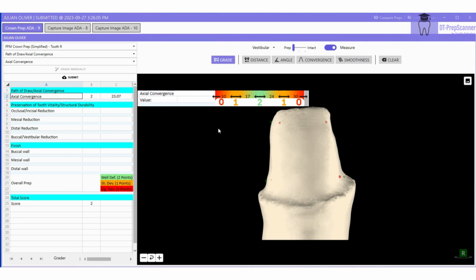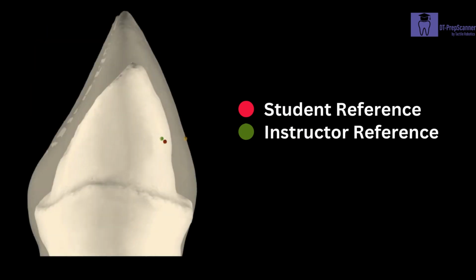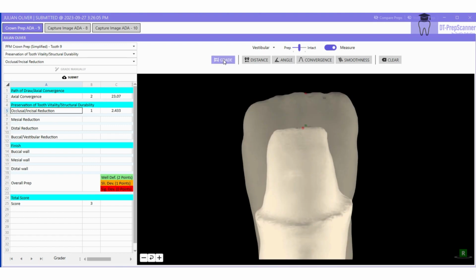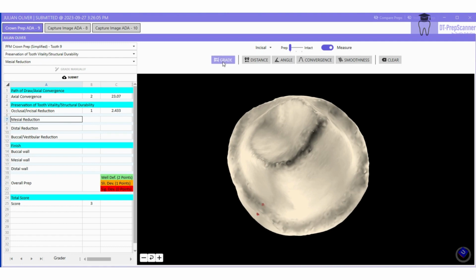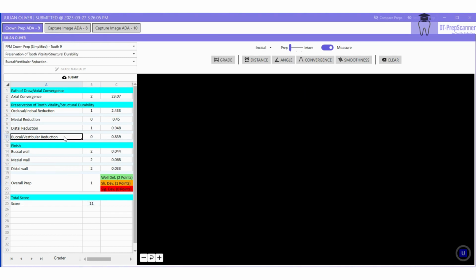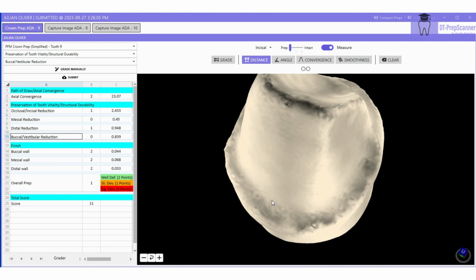To understand how the system grades the students, the software integrates the reference point values initially established by the instructor during rubric creation. Based on these reference points, the software is capable of detecting the points on which different students will be graded, automatically ensuring efficient and accurate grading. Additionally, instructors have the option to manually select the points upon which to evaluate the student's prep.